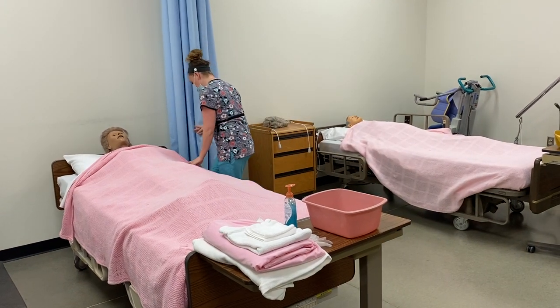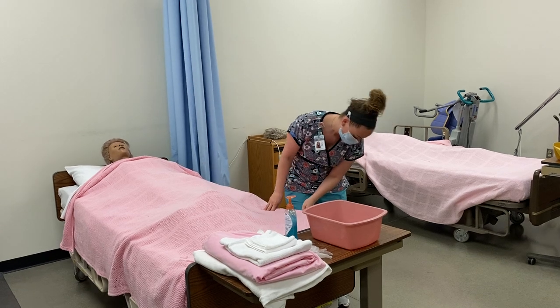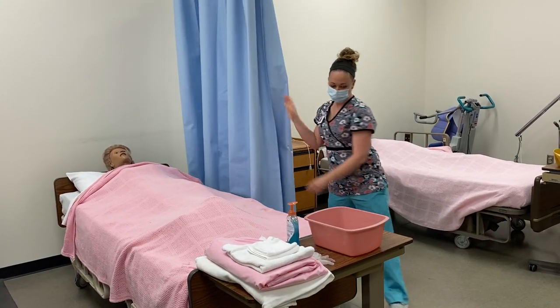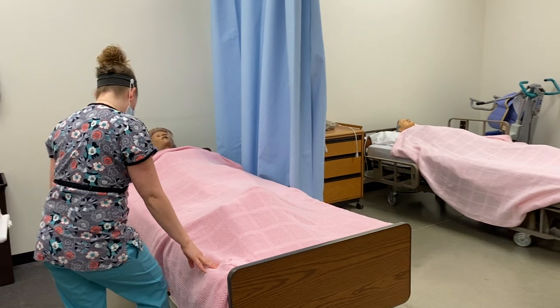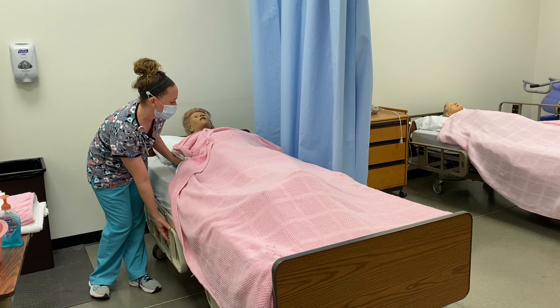I'm going to lock my bed brakes. I'm going to pull my privacy curtain. Going to raise my bed to a comfortable working height.